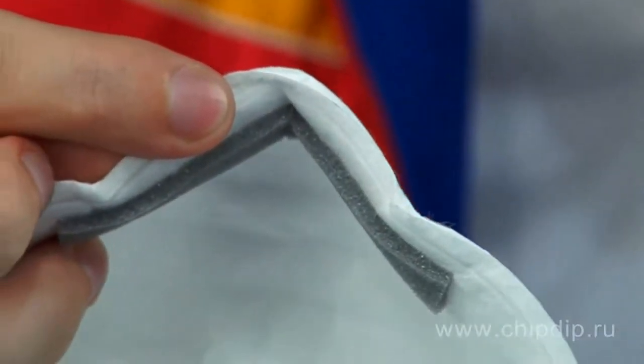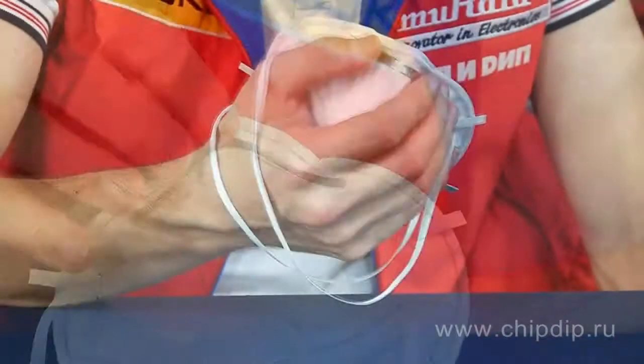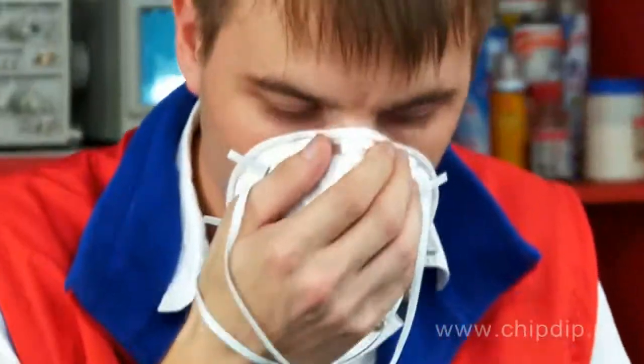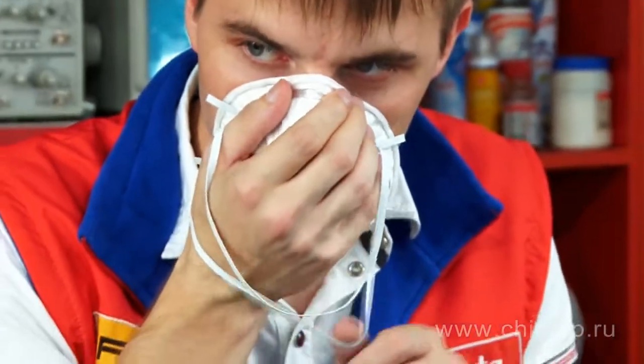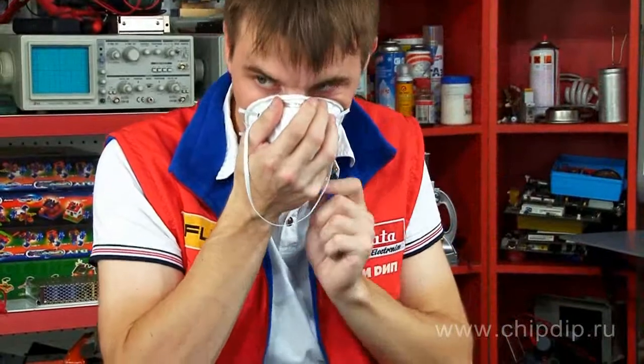The respirator is very easy to use. Just put the half-mask on your palm in such a way that the nose part would sit on your fingertips and the rubber bands would be hanging down your wrist. Then hold the mask to your face with the nose part facing up.